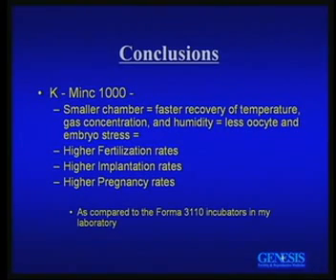So in this particular study where I looked at the same media with sibling oocytes, what I got was higher fertilization rates in the MINC, higher implantation rates, and higher pregnancy rates. And I would assume that that's because the chamber is smaller, there's a faster recovery, the gas concentration and humidity recover faster, and there's less stress on the eggs and embryos.